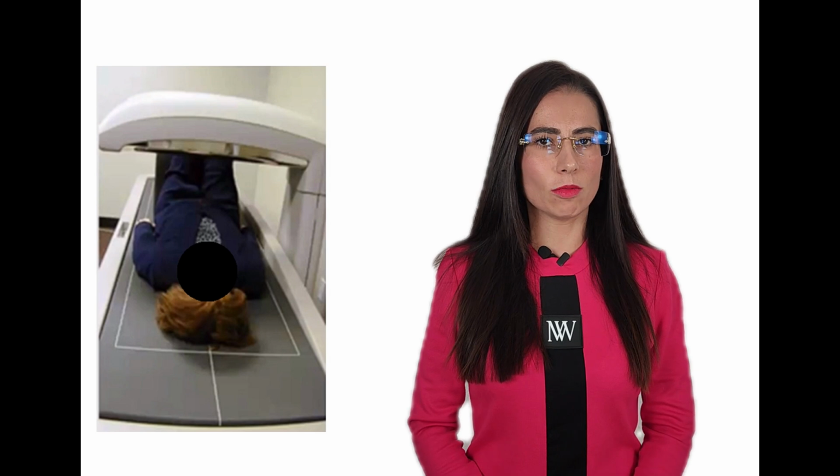patient. The spine should be centered in a straight line in the middle of the table. The legs should be placed on a positioning block with knees bent in order to compensate for the lumbar lordosis and the tilting of the pelvis. Improper positioning can lead to rotation of the spine, giving you false results with lower bone density, and therefore you could receive a more serious diagnosis.